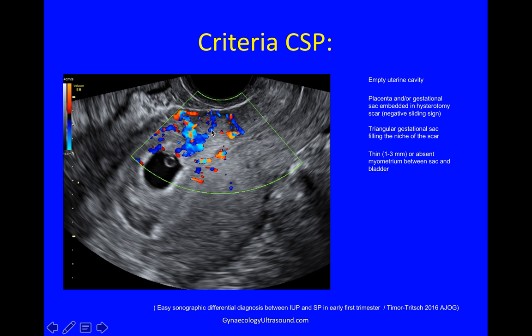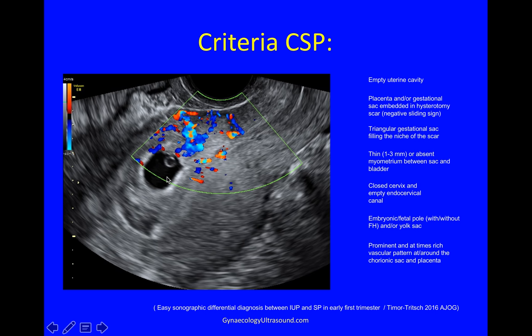A thin or absent myometrium between the sac and the bladder — in this case the bladder is empty, though it's better if slightly filled. Closed cervix and empty endocervical canal: here is where the bladder attaches to the uterus, so this is more or less the level of the internal os, and you can see the pregnancy is nowhere near the cervical canal. Then you need either a yolk sac and/or an embryo with or without a fetal heart, and prominent vascularity showing that the trophoblast is embedded in the myometrium and not just passing through in the case of a miscarriage.